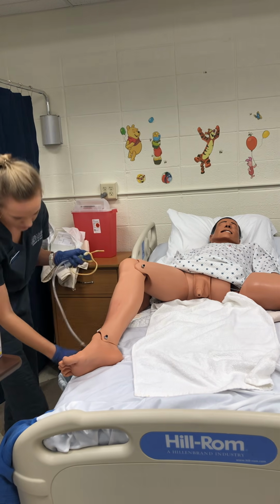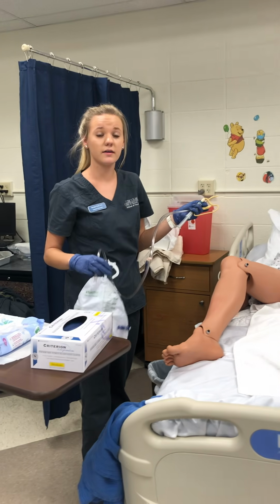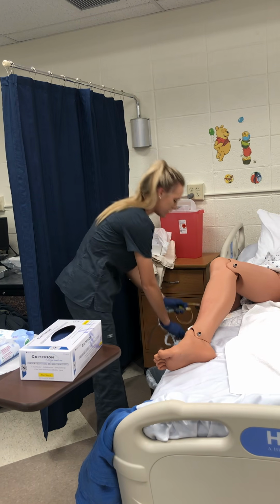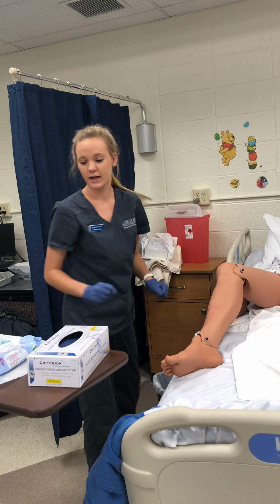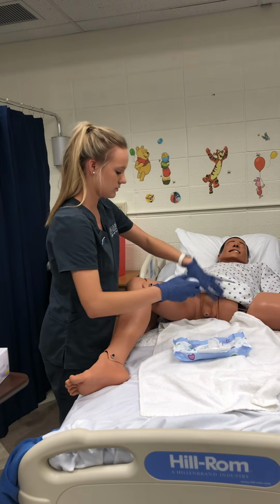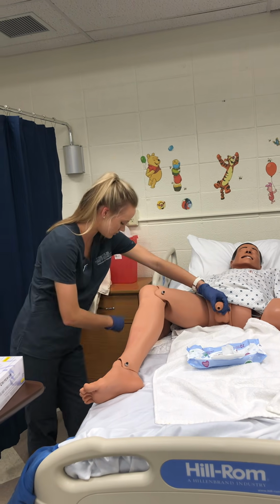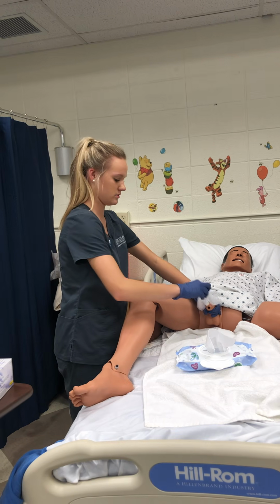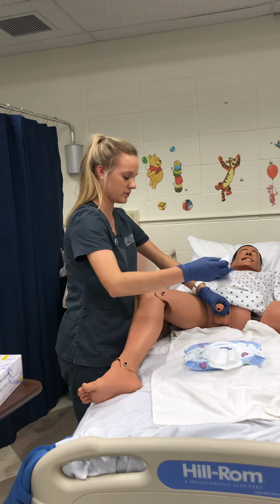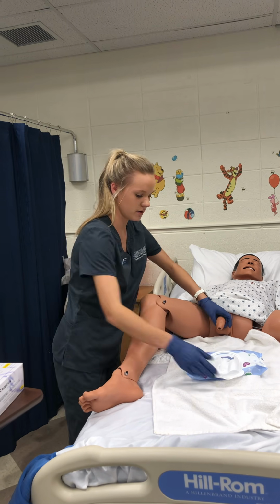I'm going to wrap all this up. I'm going to assess the color and amount and characteristics of the urine that is in there whenever I go to remove it. I'm going to throw all this away. I'm going to go ahead and clean Mr. Jones up. Same way I did before, starting at the top and working my way down in a circular motion. Three times, getting good and clean. Okay, perfect.